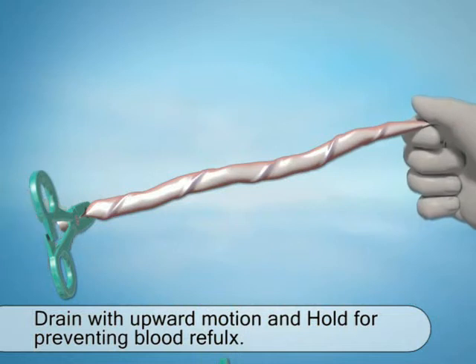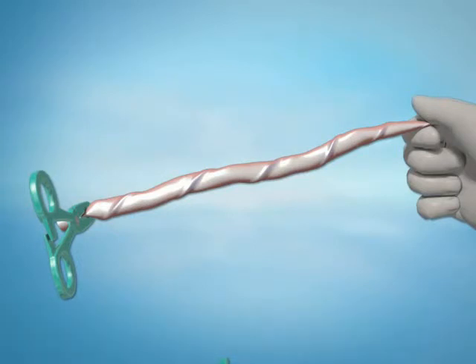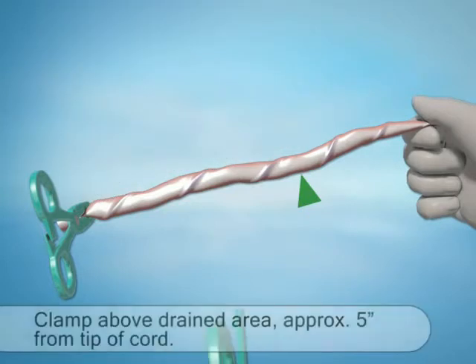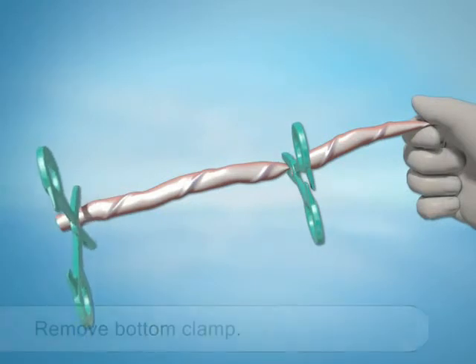Press and hold the umbilical cord in order to prevent the blood from dripping back down the cord. While tightly holding the cord, remove the ruler from the kit and measure five inches — that's 12.5 centimeters — upward from the clamp. Clamp above the drained area using the additional clamp, allowing the cord to hang freely. Remove the lower clamp from the cord.